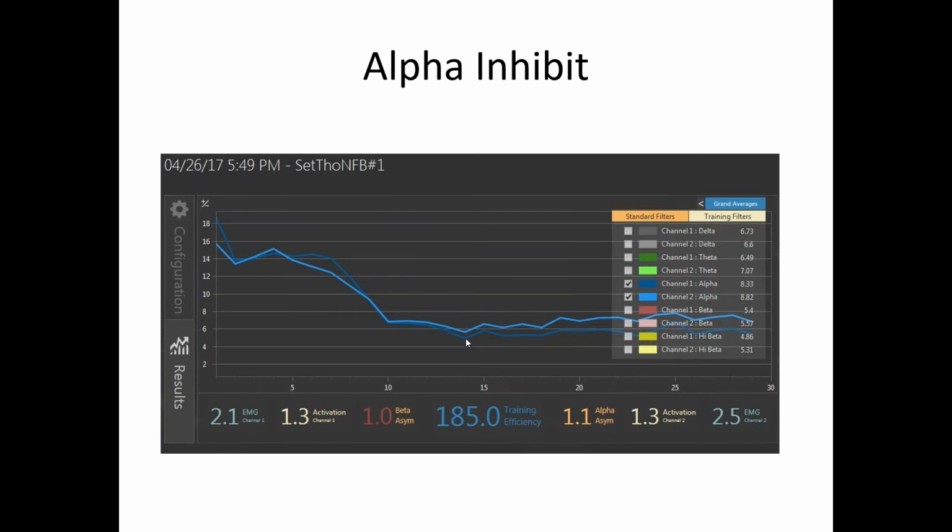This is the brain has to move, okay, we got a new sofa in, where are we going to put it in the living room? Well, let's move the old sofa out over there, and let's bring the new sofa. And so we move the old sofa out of there. Okay, and then we bring the new sofa in, and then we arrange the old sofa. Okay, that looks better. So we have a transition phase, which is reorganization, and then we have a normalization phase where the alpha moves back into a normative range.